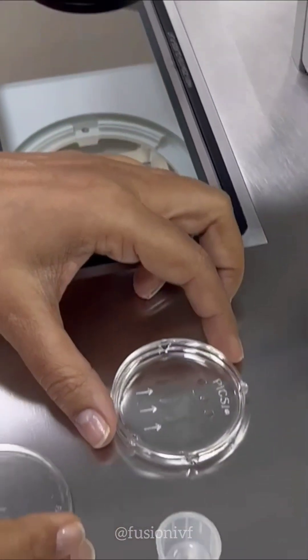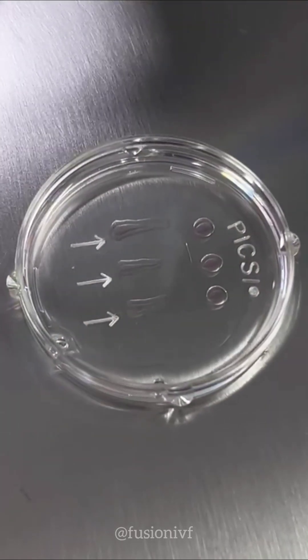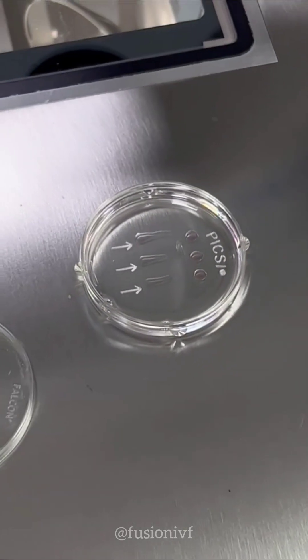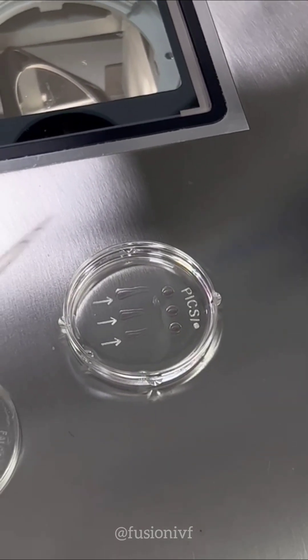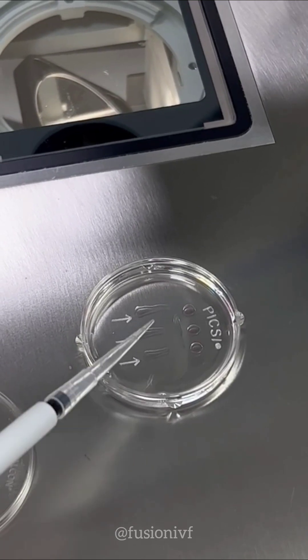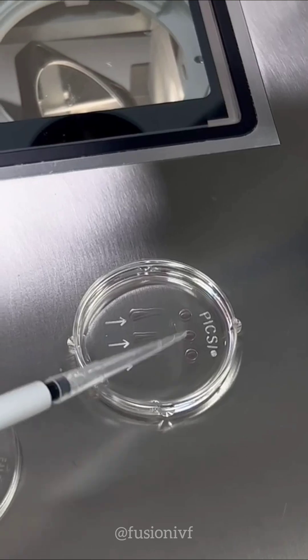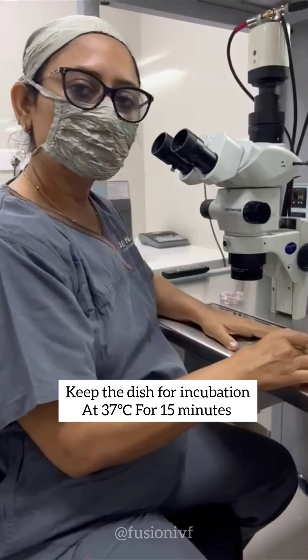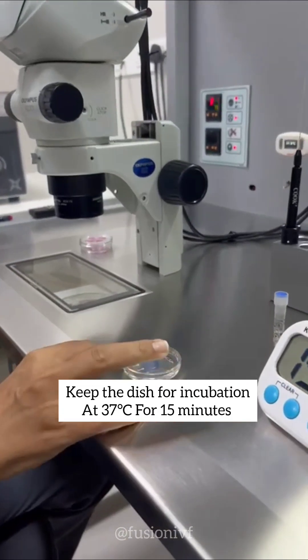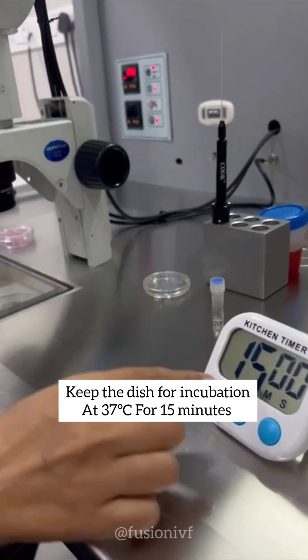So this is how the PICSI plates look like. These are the hyaluronan drops, this is the PVP drop, and here are the hyaluronan drops. Then we will load the sperm for 15 minutes.